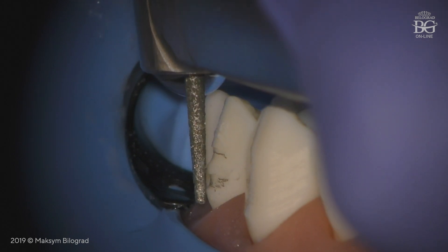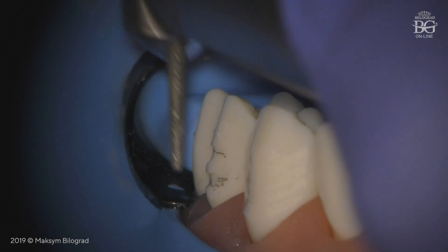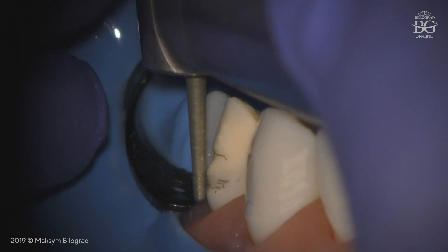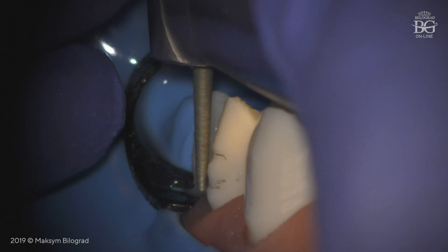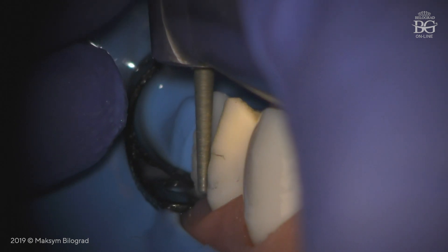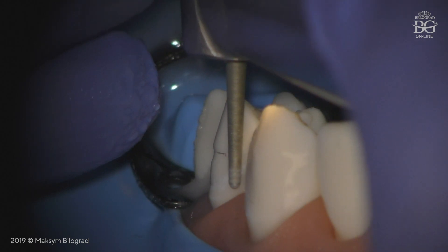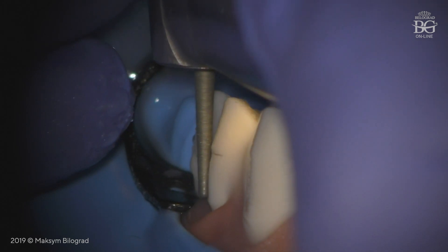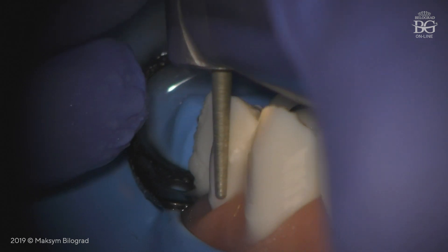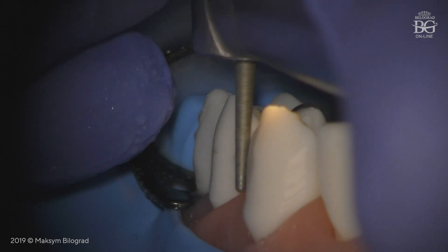So one more time: keep your burr straight and parallel to the bulbosity and you will see how you get two planes and the finish line at the same time. It is very important to control this angle. I would like to see really parallel angulation of my burr to the bulbosity. It may take some time, but at the end of preparation you will get the ideal two planes and also the finish line because of the design of the burr. We prep now until these marked lines disappear, and you will see how perfect your two planes and finish line are at the same time.